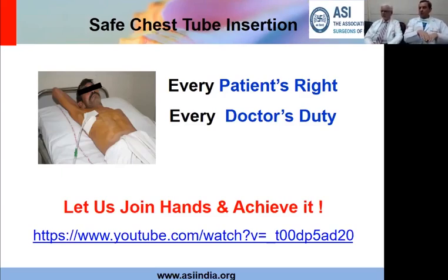So let's come to a situation called primary spontaneous pneumothorax or secondary spontaneous pneumothorax. Now these cases will present to you with pneumothorax, the lung is collapsed, you put a chest tube, and the lung expands. Now there are definite indications for intervention in these patients. When you put a chest tube, in the next 48-72 hours your lungs should expand. If the lung expands completely, your air leak should stop in about 5 to 7 days.